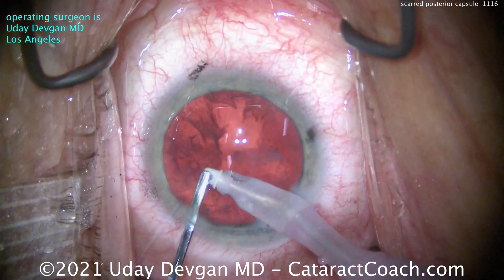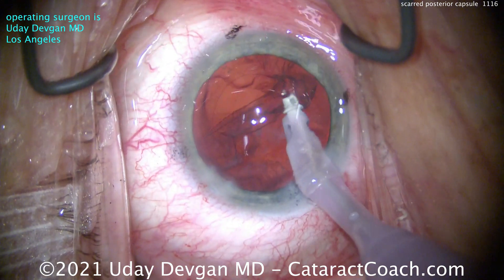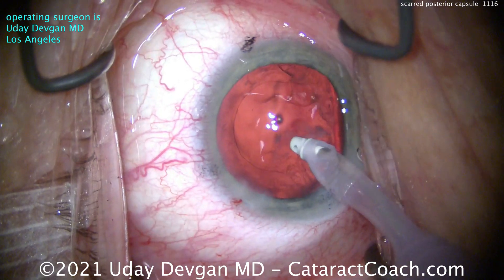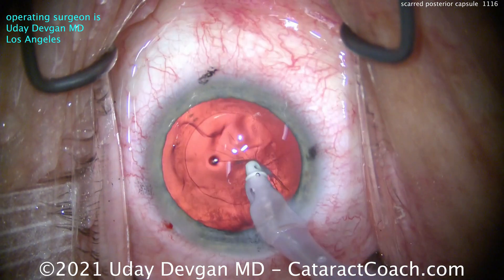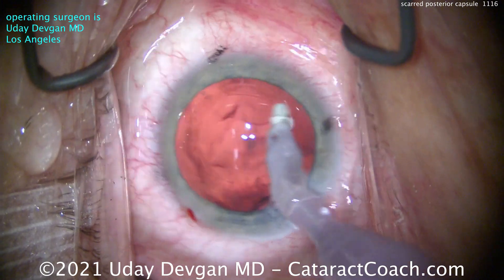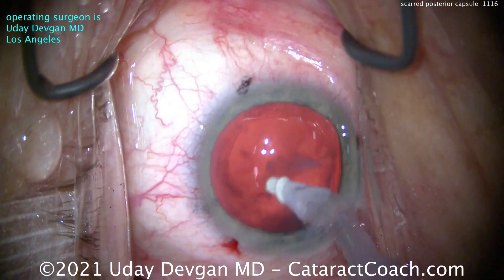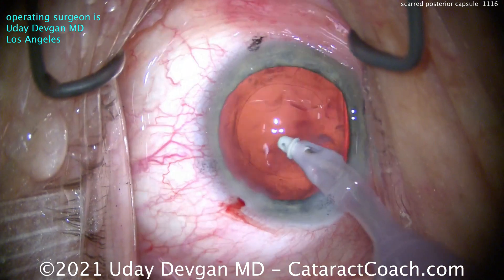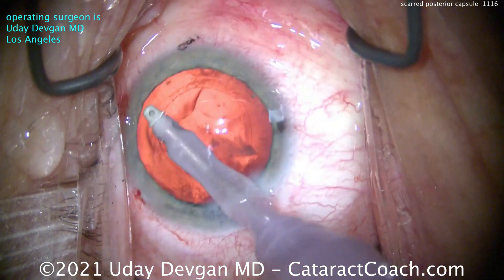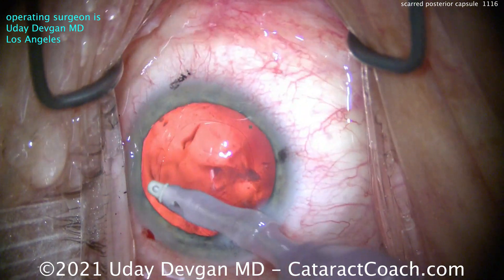Now we can remove the cortex. We did end up with a beautiful capsulorhexis — that looks great. You can already see there's going to be an opacity on that posterior capsule that's going to be tough to remove. We can certainly try; there are techniques such as using the phaco tip to rub the capsule a little bit. Some people even use phaco tips with a diamond finish to help scrape the posterior capsule, but keep in mind you don't want to cause any damage because that capsule is thin — as thin as four microns, which is half a red blood cell diameter.